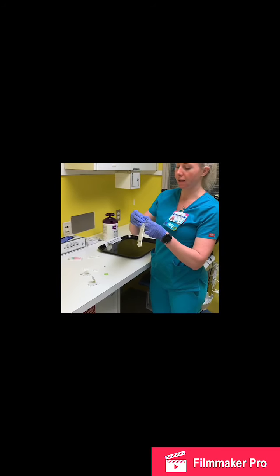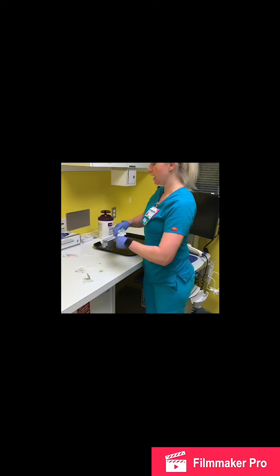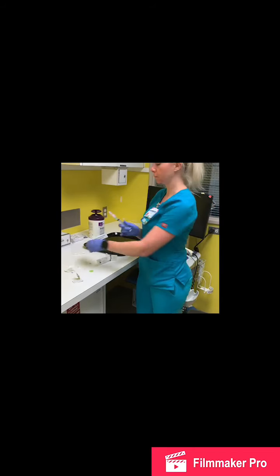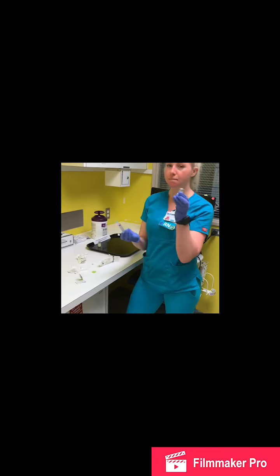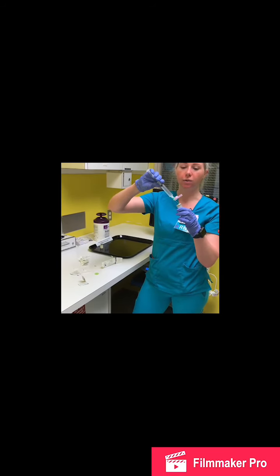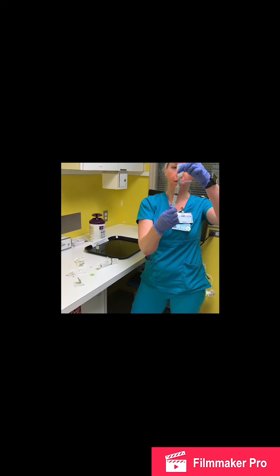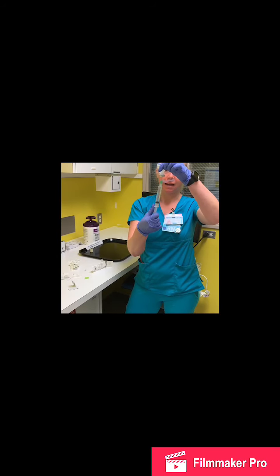So I will take my sterile 10 ml syringe and I'm going to attach my needle to the end of that, of course keeping the end of the syringe sterile and the needle hub sterile. I will remove my safety cap, and then I have 10 mils of fluid here, so I'm going to draw up 10 mils of air, and I'm going to inject the 10 mils of air into my vial. And I'm going to invert it, and I'm going to withdraw the 10 mils of diluent into my syringe, making sure that I have exactly 10 mils.